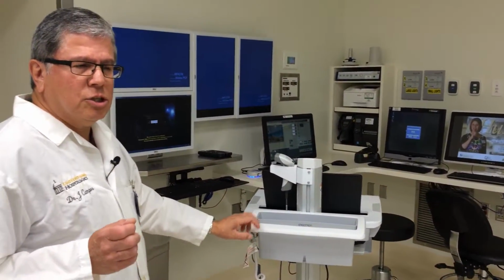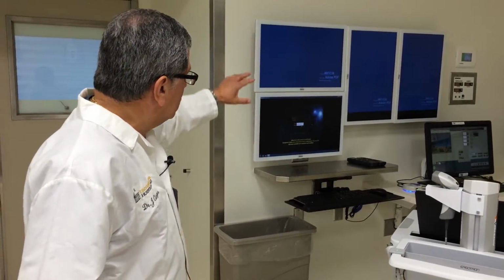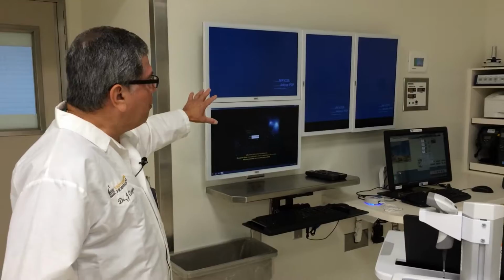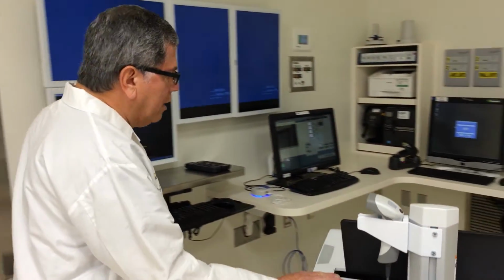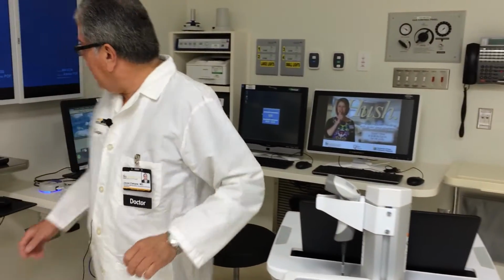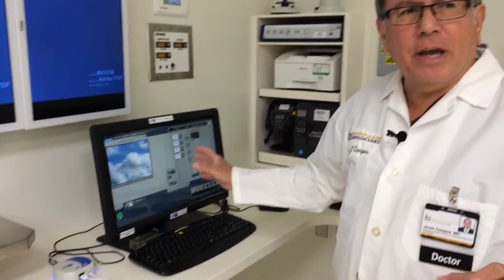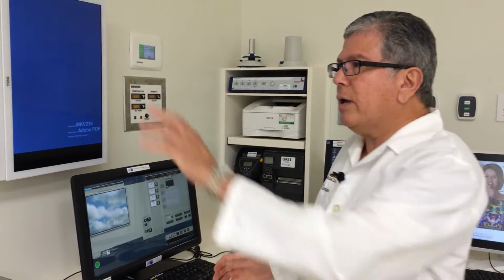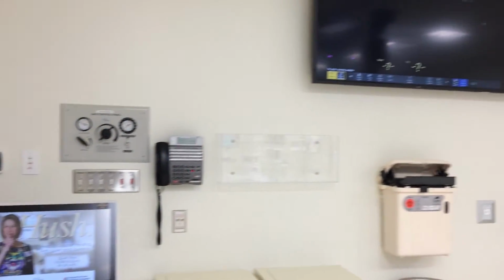Another of the advances in technology that I've seen with the design of these new operating rooms includes the integration of the PACS monitor, but also we have a system that we call integration, and that allows us to display every aspect that we want. For example, we can put the x-rays of the patient here and display in all the large monitors that you see through the room.